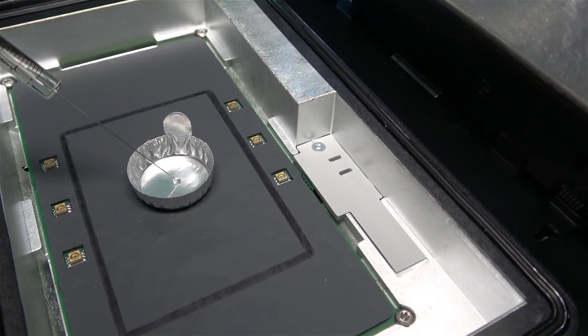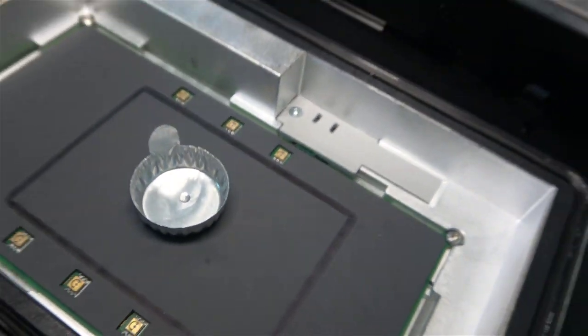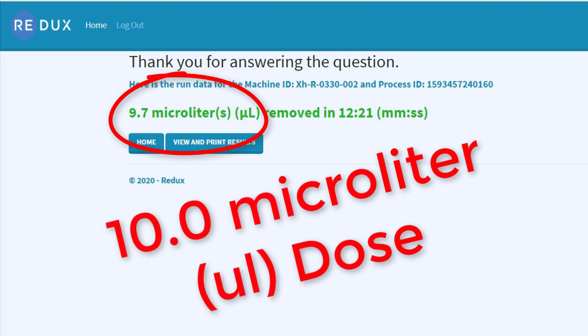My excitement doesn't stop there, because the Redux system allows me to measure exactly how much moisture is being pulled out of a hearing aid, and you know that I absolutely love to verify things to see how well they actually work. I was able to run repeated tests of a known dosage amount of water inside of the Redux test chamber and see if that amount was different from the moisture reading. The moisture measurement was not very accurate at the beginning, but when I shared this with the Redux team based in Indiana, they determined we needed to calibrate the system for Arizona, and once we did that, we've been able to get within 10% of a moisture reading — which is extremely accurate when you're talking about these incredibly small amounts of water.